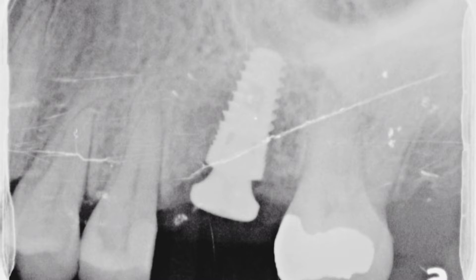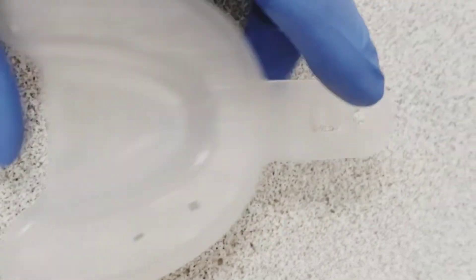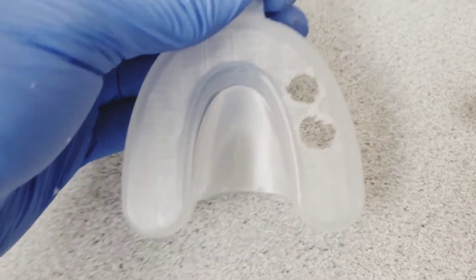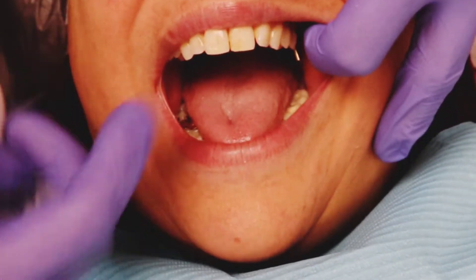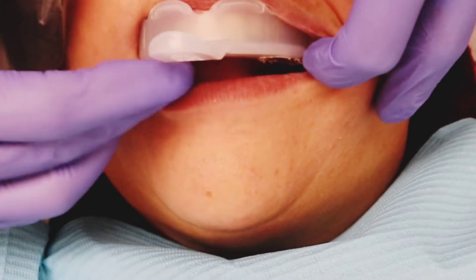First, what you're going to need is a fully integrated implant with the healing abutment in place — the second stage surgery portion already completed. You'll have to take out the healing abutment and place an impression coping. You also need your tray sized up, marked, and you have to create holes over the area where your implant is. I like to go a little bit bigger with the size of the hole.